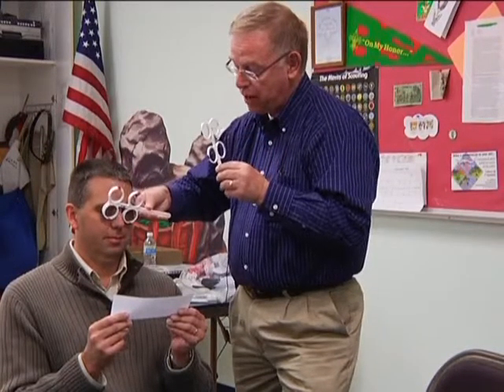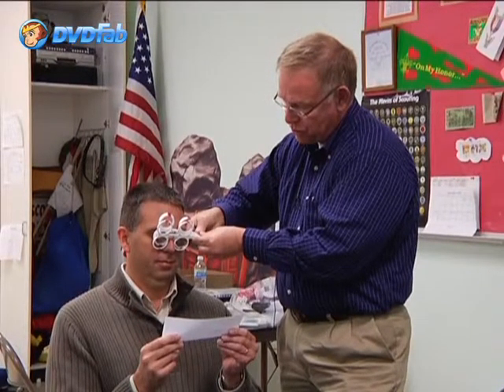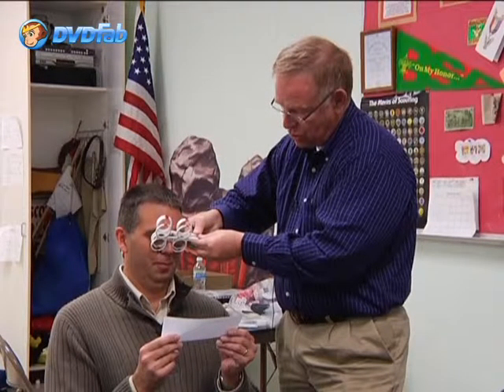What do I do? Compare choice 1, which is plus 1.25, choice 2, which is plus 0.50. Compare choice 1, choice 2. One or two? Maybe two. Two. One or two? Two.